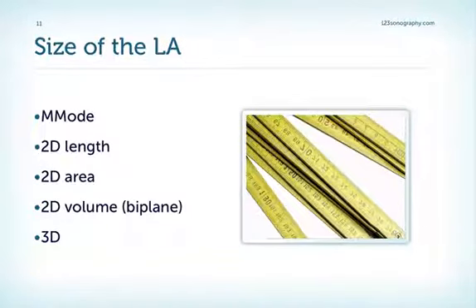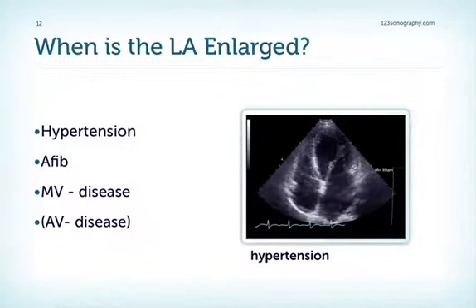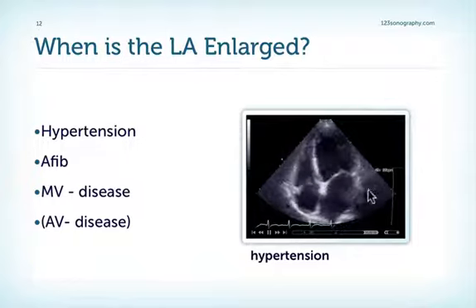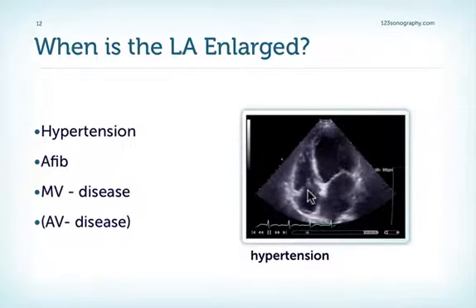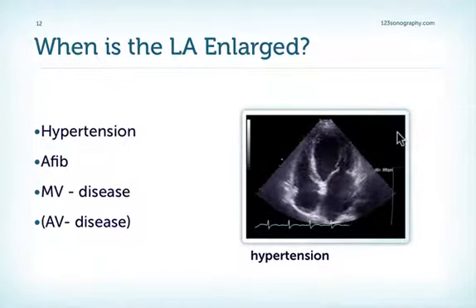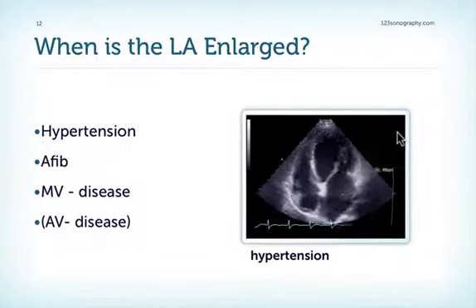There are a number of ways of quantifying the size of the left atrium: M-mode measurements, length measurements, area, volume measurements, and even 3D echocardiography. The left atrium is enlarged if the left atrial filling pressure is elevated, for example in hypertension. This patient has left ventricular hypertrophy and an enlarged left atrium — compare its size with that of the right atrium. Hypertension is probably the most common cause of left atrial enlargement, simply because it is such a common disease.